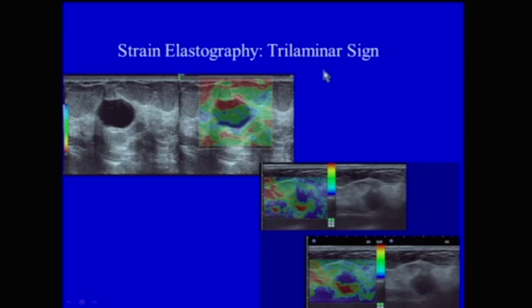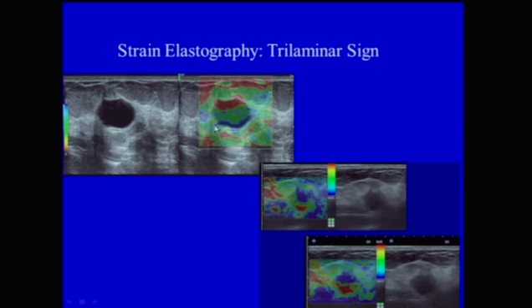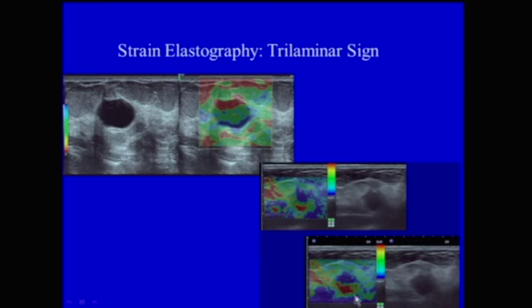In strain elastography, the trilaminar sign has been described in patients with debris-containing cysts, where three colors — red, yellow, and blue — are seen. This should help differentiate debris-containing cysts from cancer. However, a recent case showed an irregularly marginated hypoechoic mass suspicious for malignancy that produced the trilaminar sign on elastography, suggesting it was benign. Because of the morphology, it was biopsied and proved to be a mucinous carcinoma. So morphology is most important — you need to be careful.